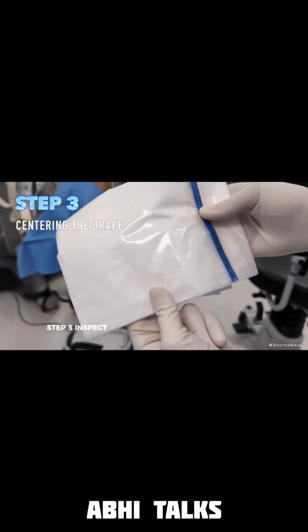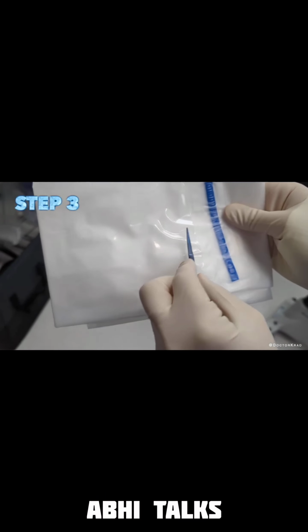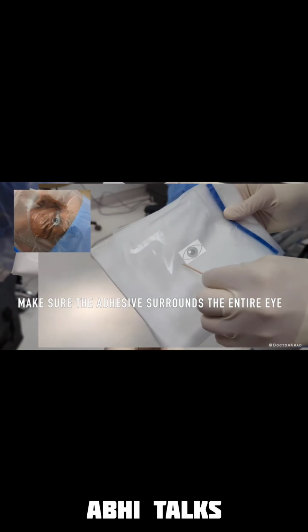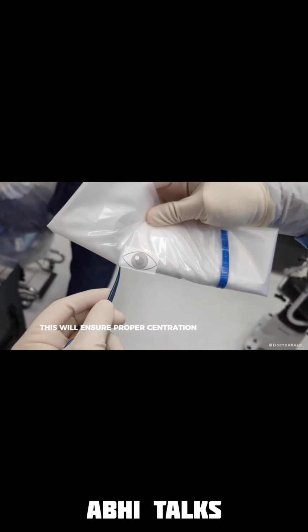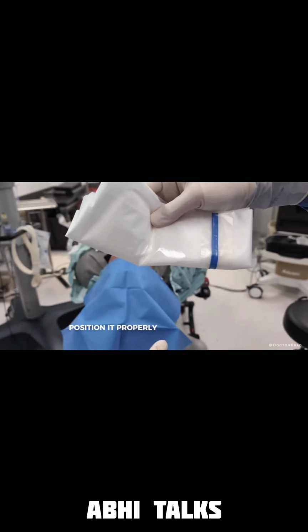Step 3. Inspect the adhesive portion of the drape. The adhesive portion may be small and circular, and sometimes it's large and rectangular. Assess where the eye will ideally be positioned. Create a fold where you expect the medial canthus to be. This will ensure proper centration of the adhesive. It will also create rigidity in the drape, which will help you position it properly within the eyelids.